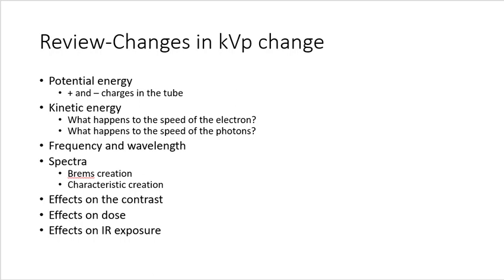So all these QA tests have to be conducted. For kVp, they come in and make an exposure on an ionization chamber, a device that in a lot of cases does a lot of different things. It can measure kVp, and it can measure mR per mAs output and a lot of other things.